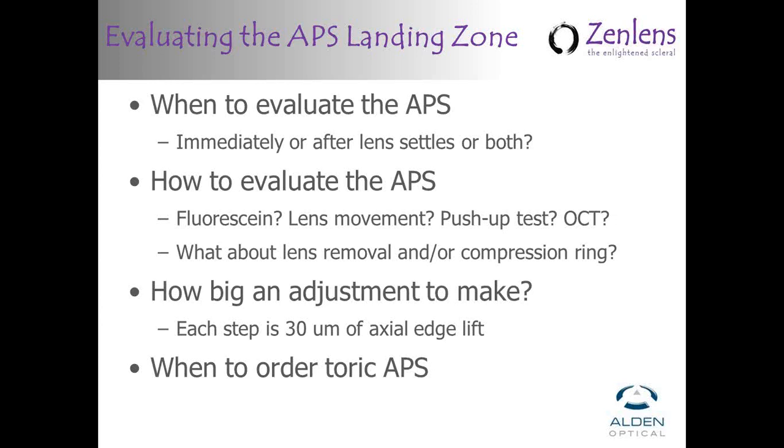Let's talk about, obviously on follow-up, timing is not much of an issue. It's going to be however long the patients have the lenses on the eye, and I think as long as they've been wearing the lens for at least an hour or so, you're probably going to get a pretty good sense of how that lens is landing. But when you're doing a diagnostic fitting, Dr. Jedlicka, do you look at the edge shortly after you put the lens on, or do you like to wait until it settles a little bit, or some of each?